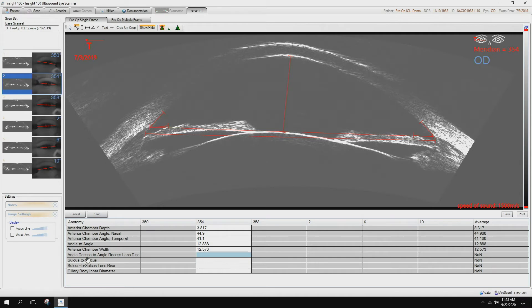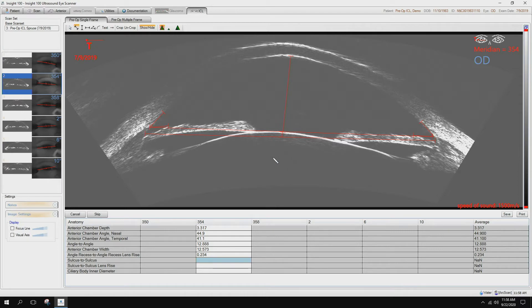Angle recess to angle recess lens rise, from here to the front edge of the natural lens.